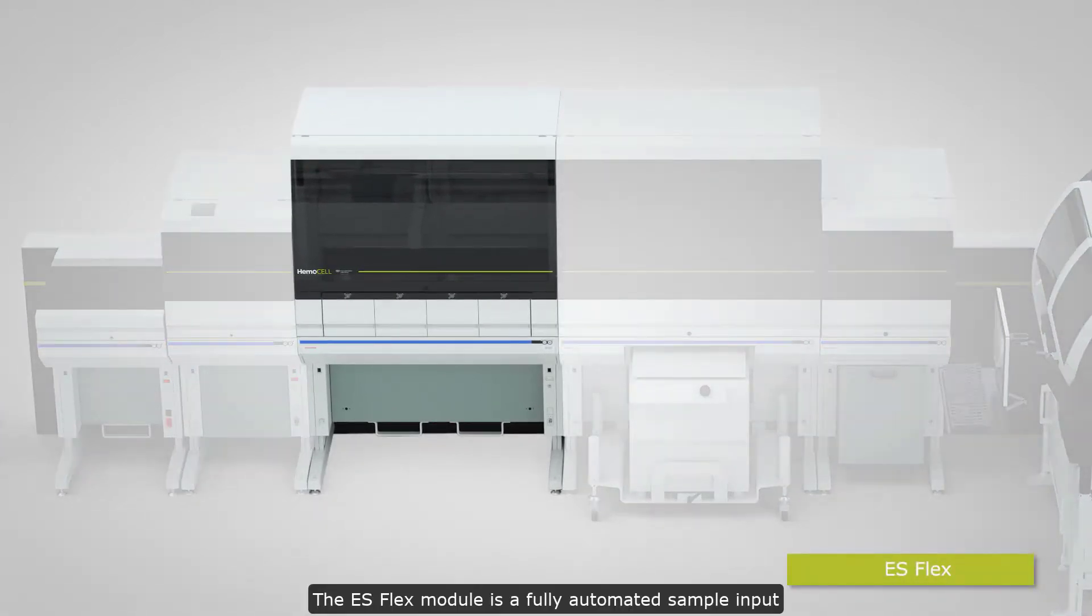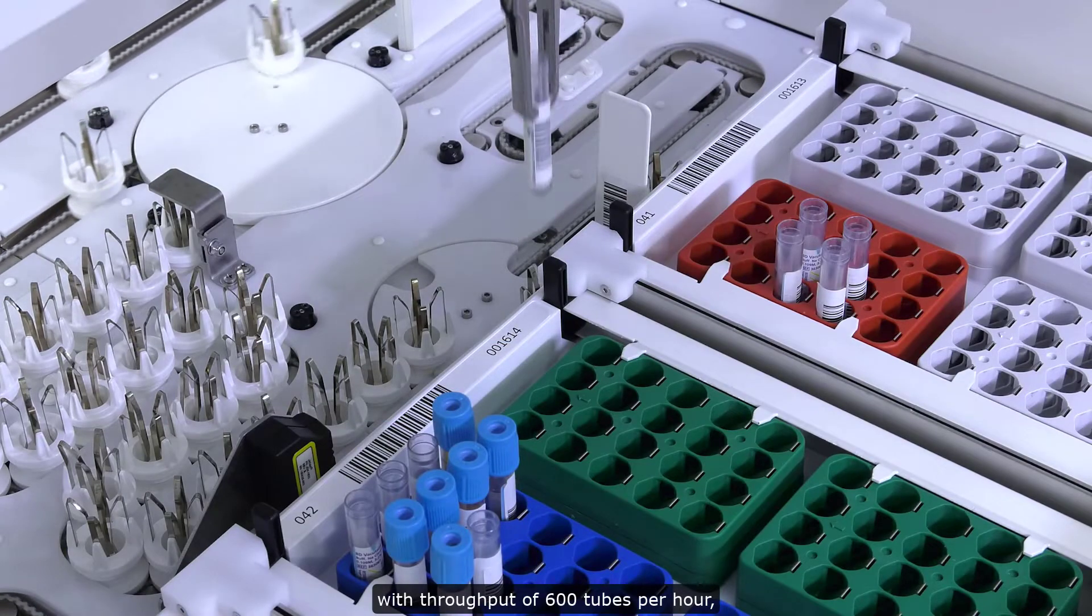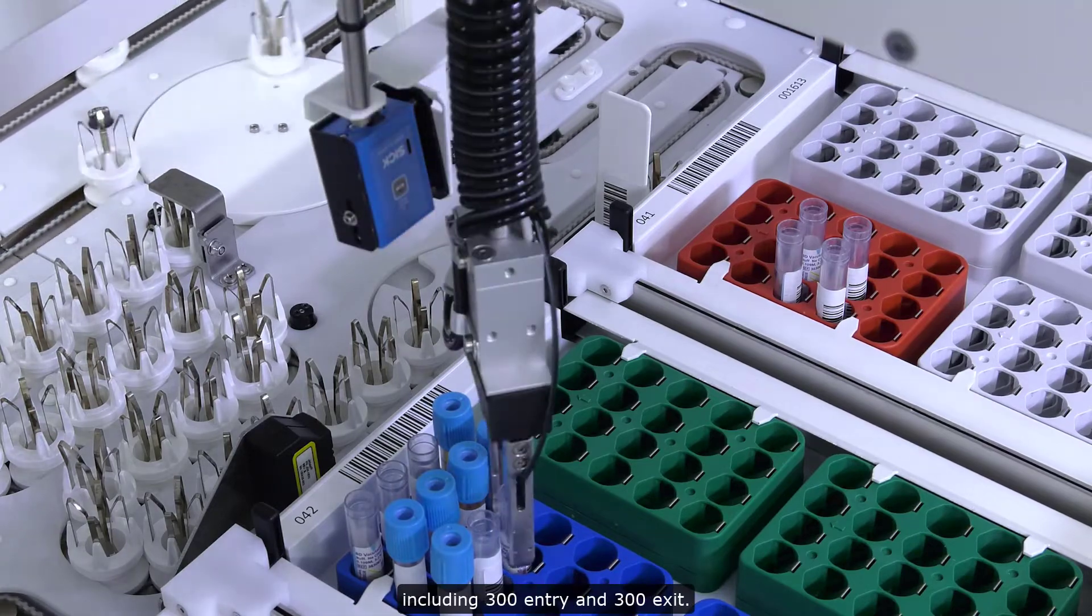The ESFlex module is a fully automated sample input and sorter module with throughput of 600 tubes per hour, including 300 entry and 300 exit.